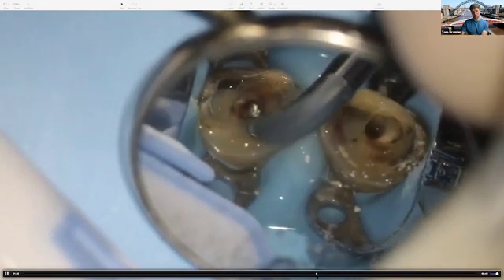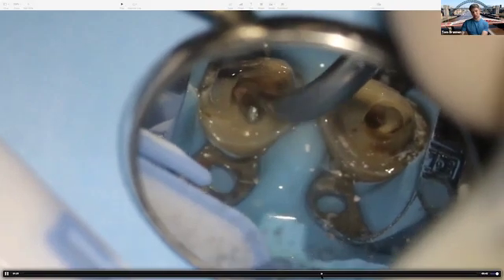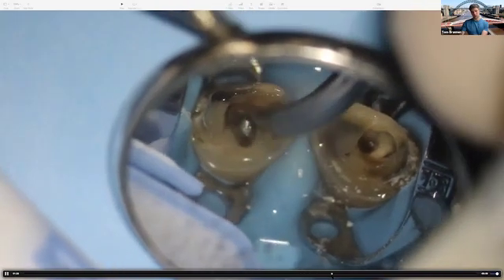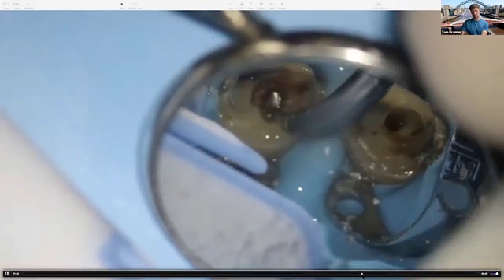Running it with water, sometimes when it's dry, but you've got to be careful if you're running it dry that you're not overheating everything, because these tips will get red hot if you're not using them with water, and as well as the post, it can then end up heating the dentine, etc. So you don't want to overheat it. So again, using water. Other way is just to occasionally blast a bit of endofrost onto it if you're worried that things are getting too hot.